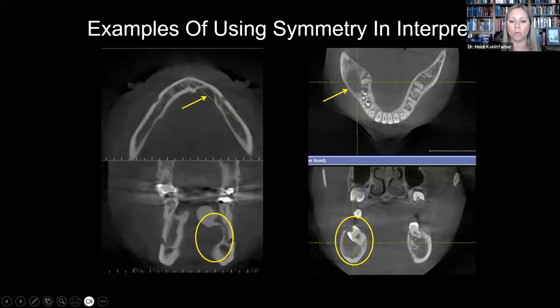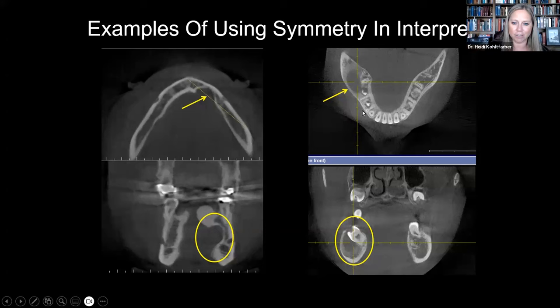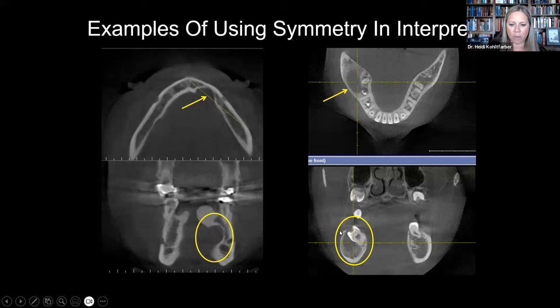Here's another one. Again, I can use symmetry to compare. In this particular software, the patient's nose is down. We still have our right side and left side — radiology's still flipped like normal. We can see expansion of the cortical borders on one side, looking very different than the other side. In the coronal sections, there's definitely expansion and remodeling of the cortical borders. We have a mixed density entity and displacement of a tooth. Even if we don't know what that is, we know something is not right and we want to refer that on to be evaluated by oral maxillofacial radiology.